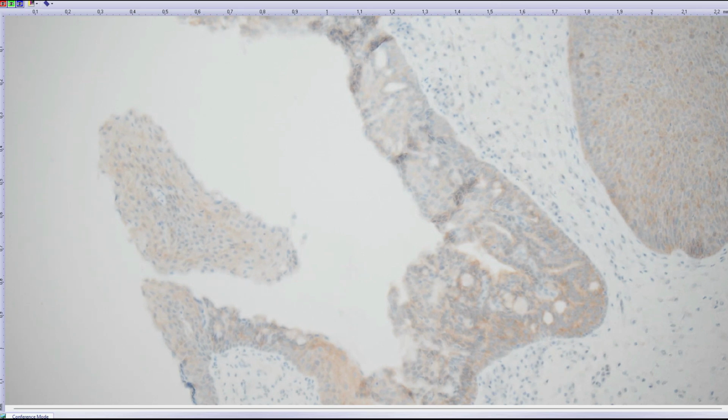And BRAF is one of the recurrent alterations; tubulopapillary low-grade seromucinous carcinoma can have many types of recurrent lesions, and BRAF is one of them. Especially, BRAF is mutated in tubulopapillary carcinomas that have a double layer, including a myoepithelial layer.